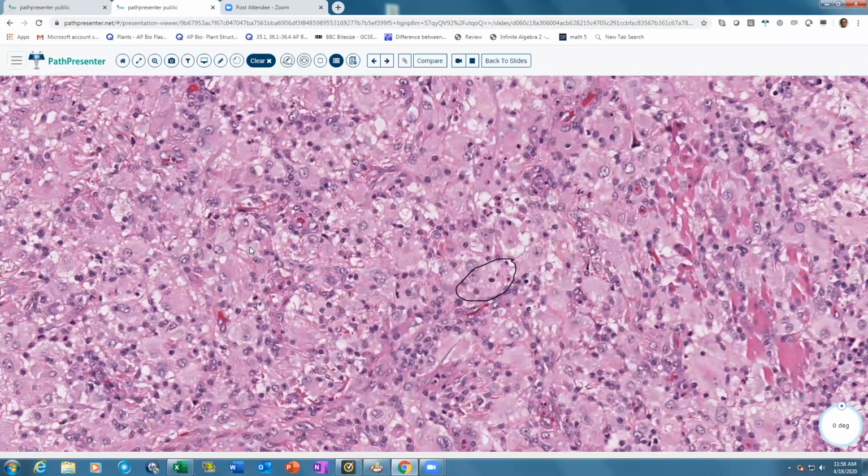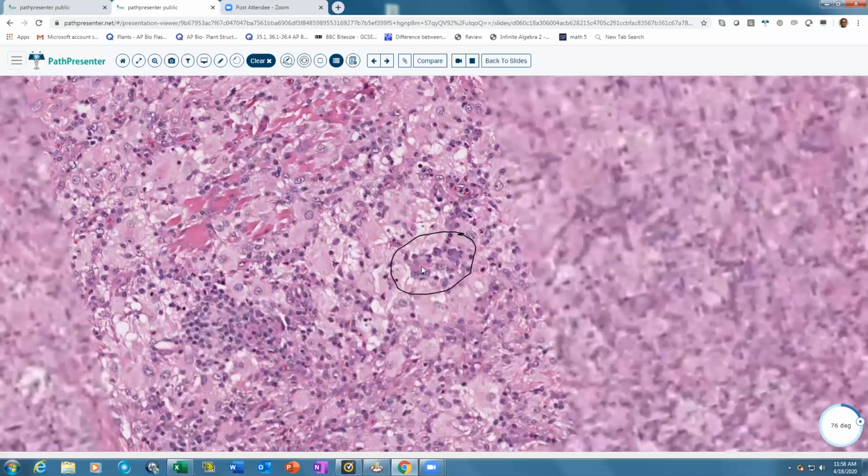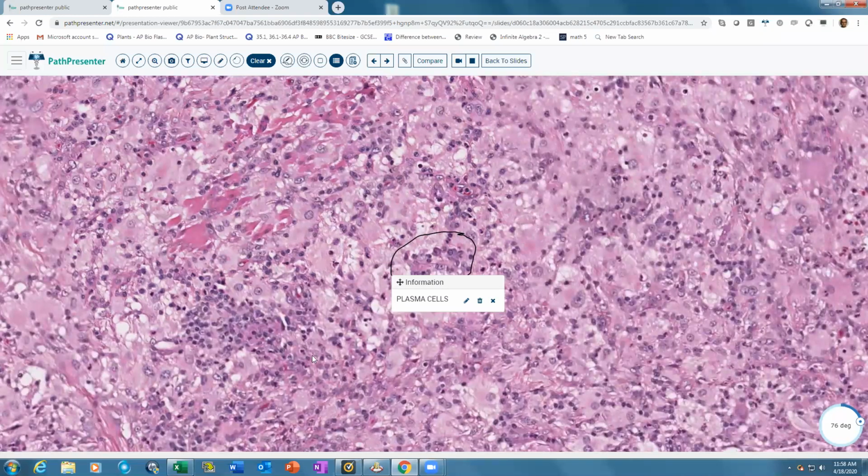One cell that is always present is the plasma cell. So if you see this histiocytic proliferation and then you look around and you see the plasma cells, Rosai-Dorfman should always come to your mind. Then you do the S100, CD68, you look for this emperipolesis, and then you can make the diagnosis of Rosai-Dorfman disease.